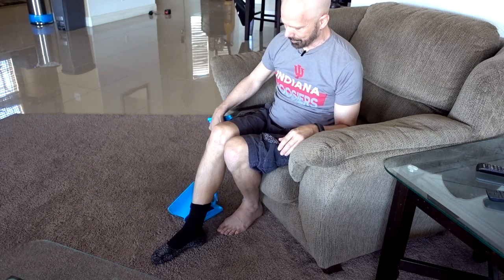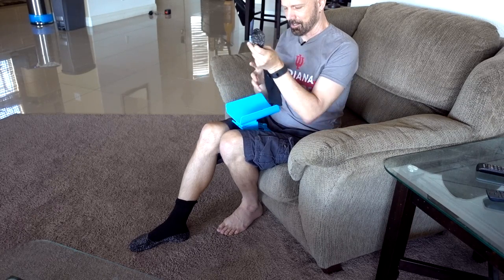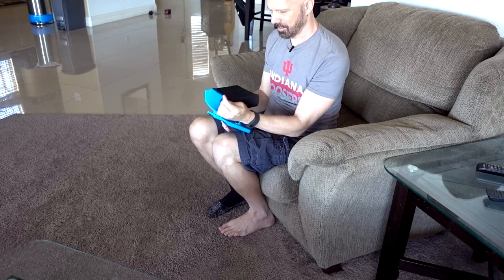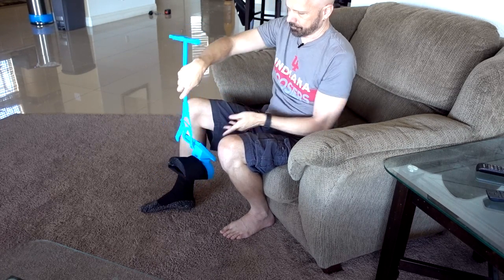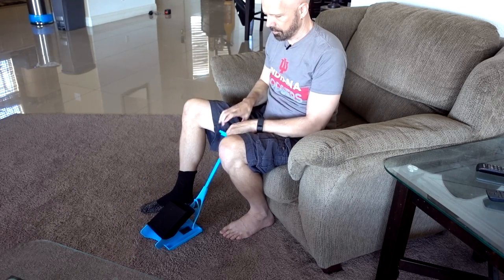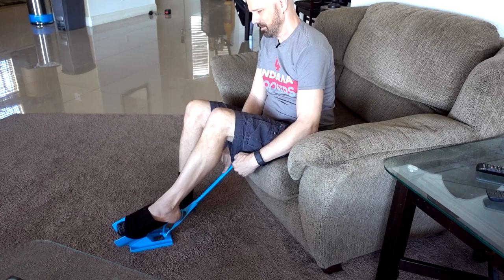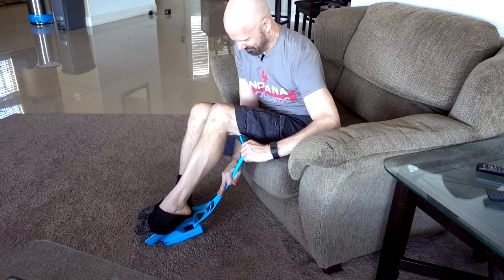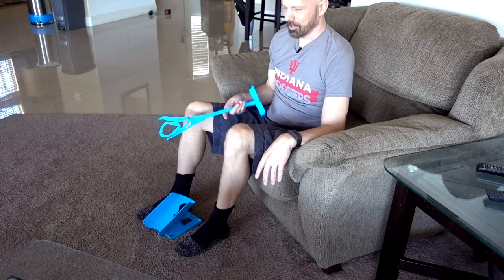Now I can't bend over, so I'll pick this up. Try sock number two. I can't bend over. Now for the left foot. Okay, there you go — I did it.